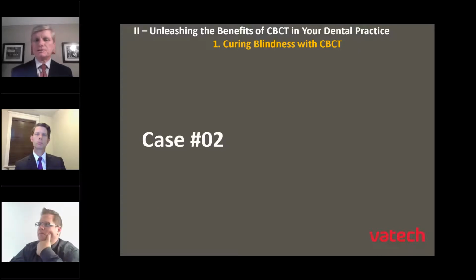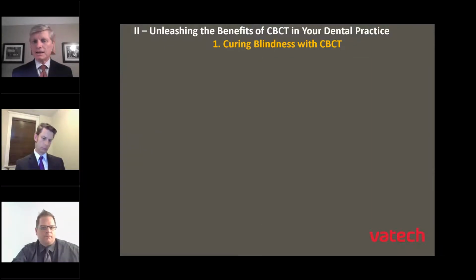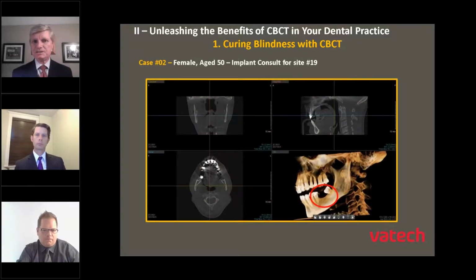So let's look at case number 2. This scan was taken with our Green CT, 18 by 10 field of view. It was a CBCT scan taken on a female, 50 years old, who was considering doing an implant at site number 19.